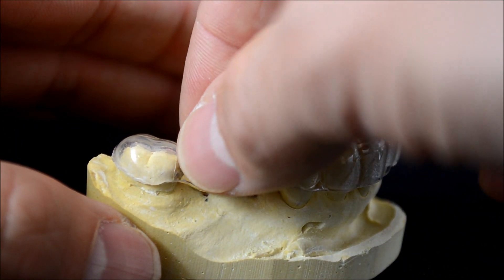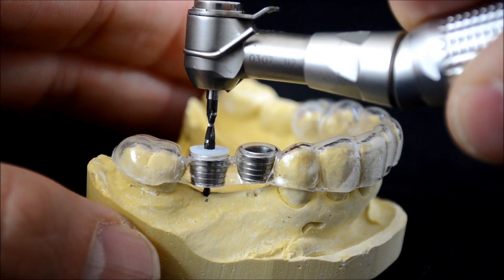Before your first case, we will design stops to work with each of your standard or guided implant drills.